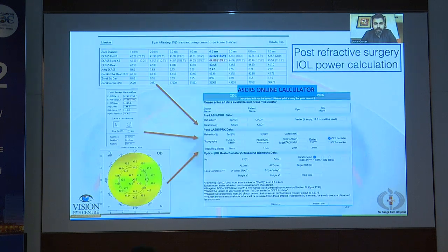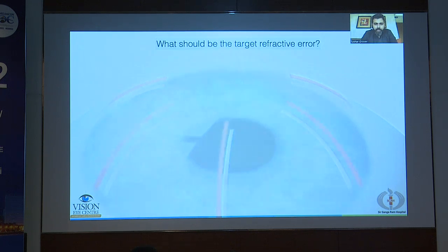Now, in post-refractive cases, all you need to do is feed these values into the ASCRS online calculator, which then gives you a measurement of the IOL power from different formulae, and you can take the average of that and use that for your calculations.